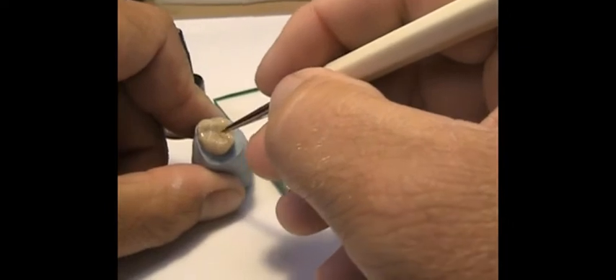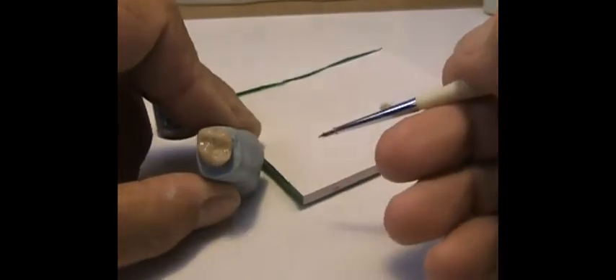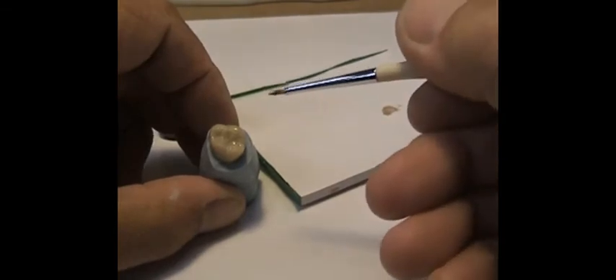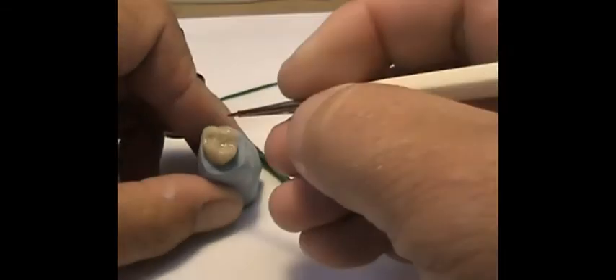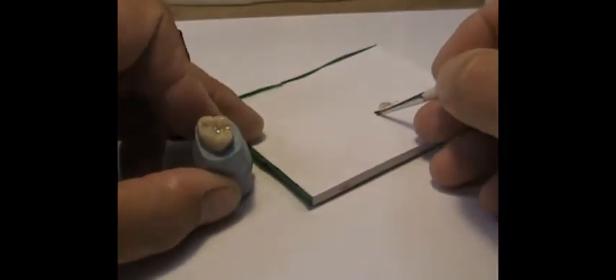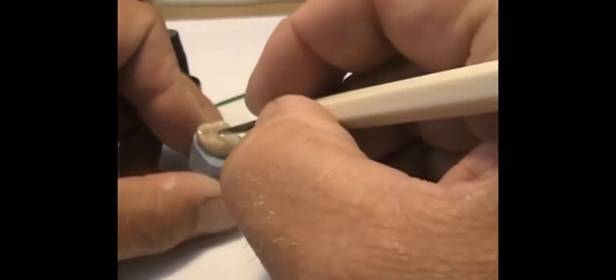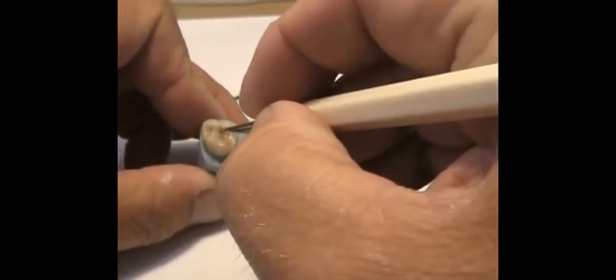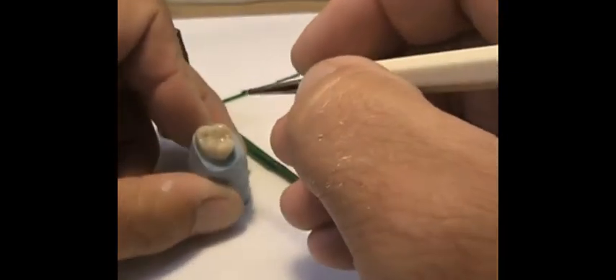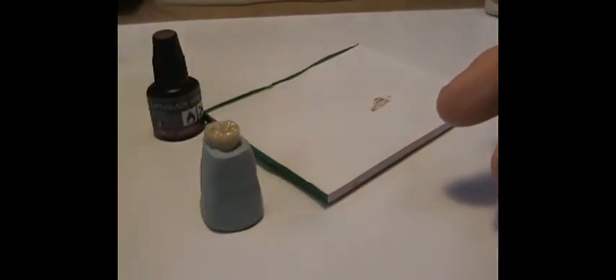I take a little bit and with a thinner, pointed brush I just go into the cracks. Here's a tip: the brush from the kit — I let it cure into a point so it's stiff, and that way I can run it up and down the pits and fissures. It keeps that point because it's been cured with the OptiGlaze on it. If you get a little heavy-handed, you can always wipe them off if you get too much on the planes. Our concentration is really down in those pits, fissures, and grooves.